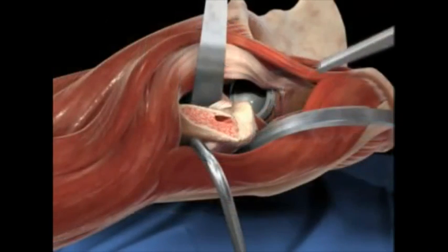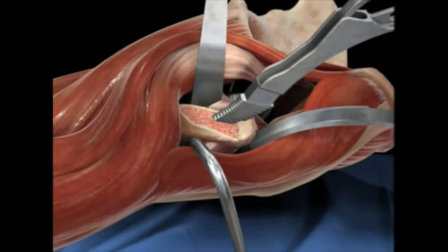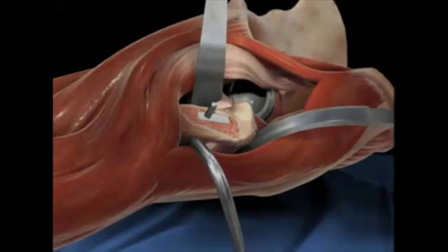And then we begin broaching for this implant. Again, similar implants to a posterior approach. And then once we like our size, we put the trial head on and reduce the hip to make sure that we like it.